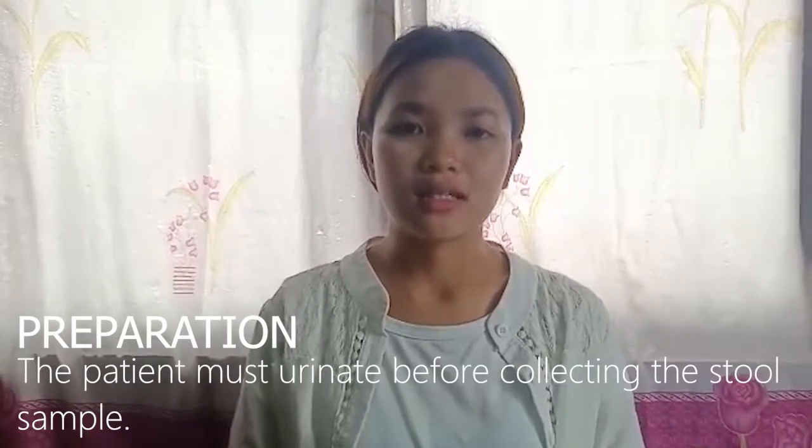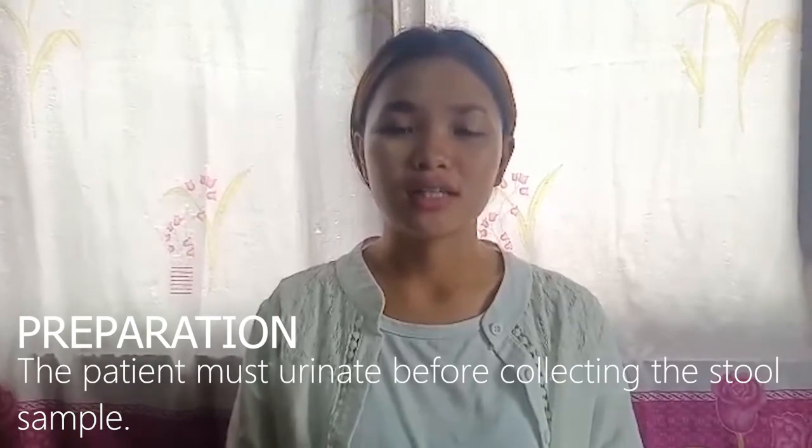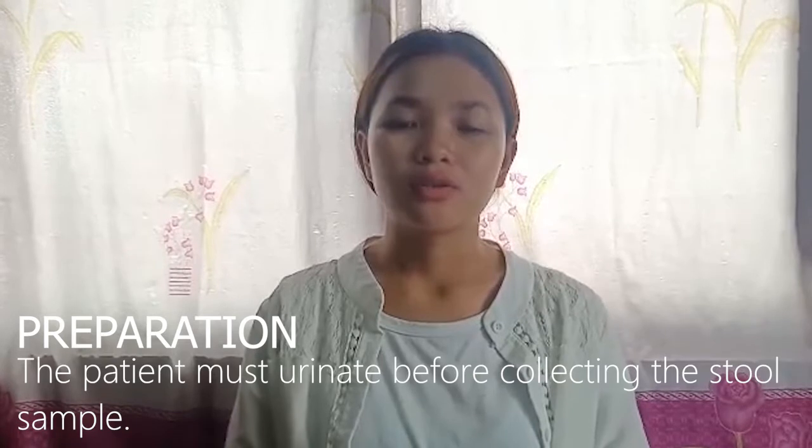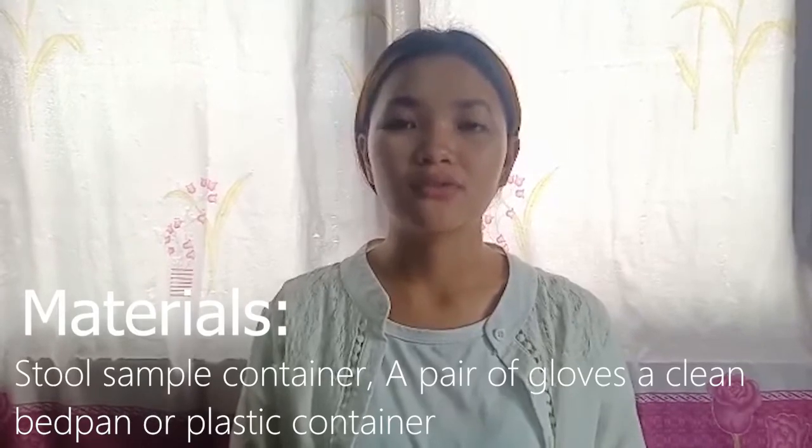The second is the patient must also urinate before collecting the stool sample to prevent urine from mixing with the collected sample.